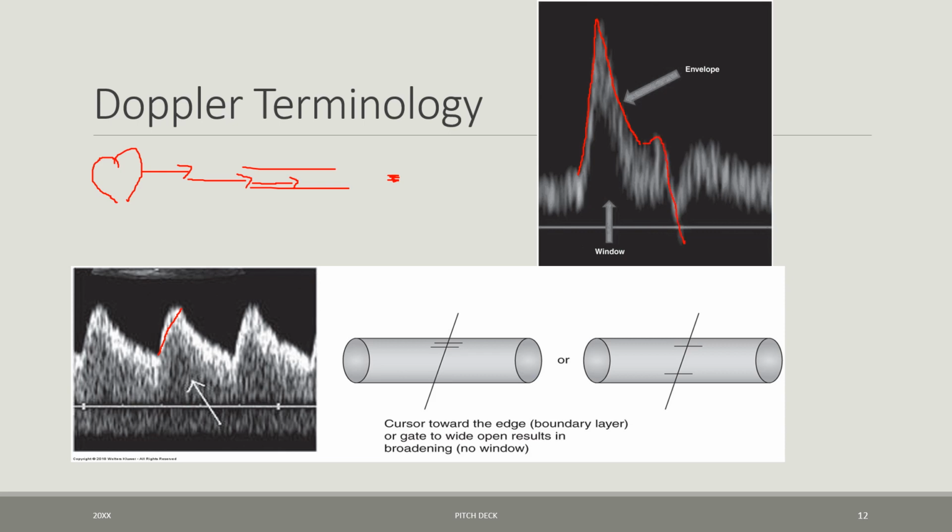Then you happen to see this little reversal. Now, this can happen in some instances, but not all, as you look at this example. When you have this little reversal, that means that there's some sort of pressure up ahead that is exerting so much pressure that when the heart isn't pushing blood forward, this pressure ahead is actually causing it to push back. And that's what this reversal is. Right here, my red blood cell started going forward, forward, forward, forward, forward. Heart released in systole, started diastole. The speed of that forward flow slowed, but forward flow continued. And then all of a sudden, the pressure up ahead was so great that it pushed back against the blood. And for this little moment in time, the blood flow reversed.